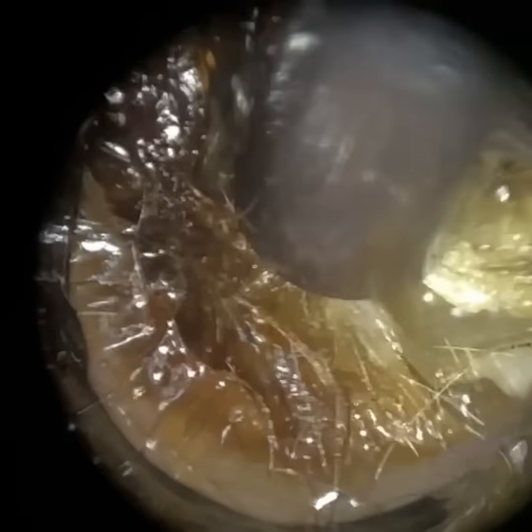And again, this is the widening, and you're going to see me bring in the skin plug. There is a bit of wax as well. Because it's a widening in front of the plug, the ear canal's narrow, so I'm having to almost drag this through this narrowing. You can see here, I'm trying to pinch it inwards. So this is the wider part. You can see the plug is coming from behind that visible flesh on the right-hand side. And it took a while.